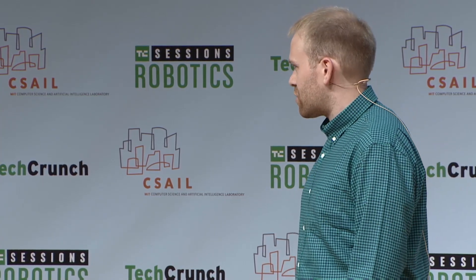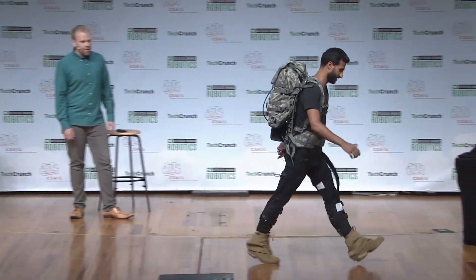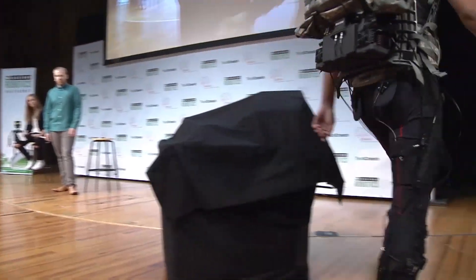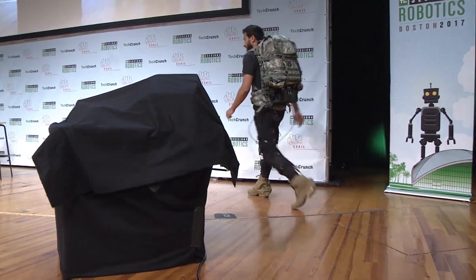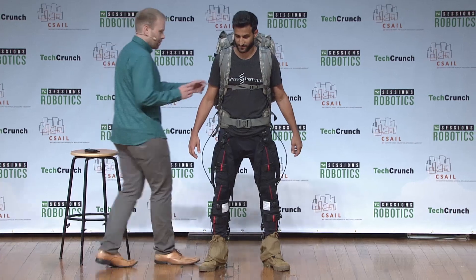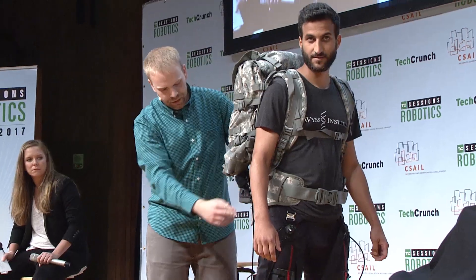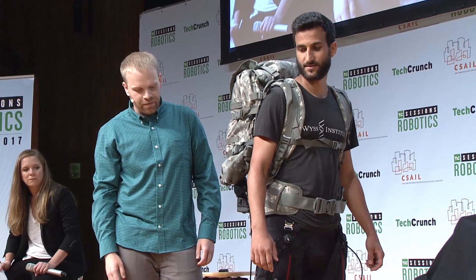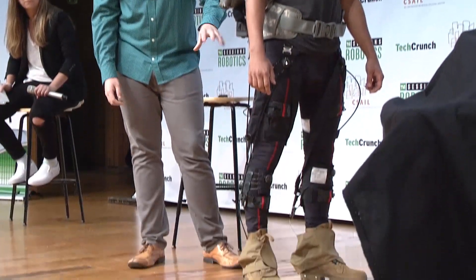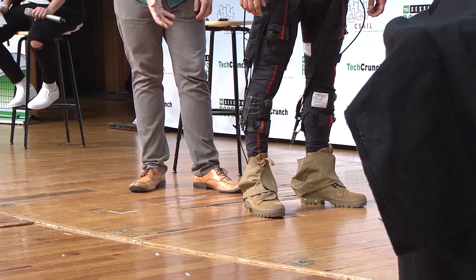I'm going to ask him to come out on the stage. So the first thing you'll notice about an exosuit, as opposed to an exoskeleton, is there are no big rigid components strapped around the legs. We've taken all of the heavy things and put them up here — all the motors, the gears, the electronics, all of that kind of stuff. And on the legs, all we have are soft textile components, some sensors, and some anchors for cables.